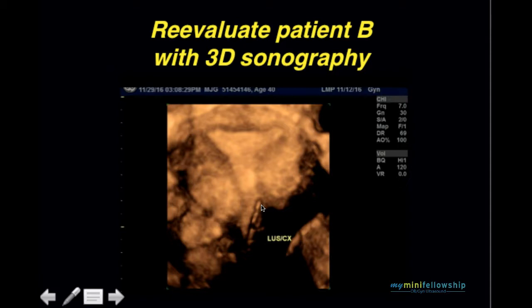What I am saying is that I have been very impressed with cases where I could so much more easily see what was going wrong by doing a 3D image. And I highly recommend that sonographers start practicing doing this. It takes some practice. And that radiologists and gynecologists ask for these images so that their sonographers will practice and learn to get them.